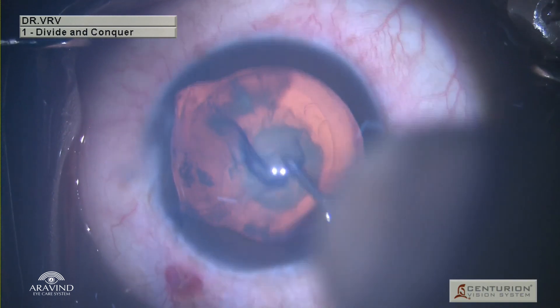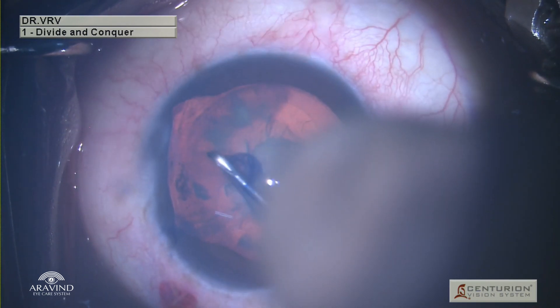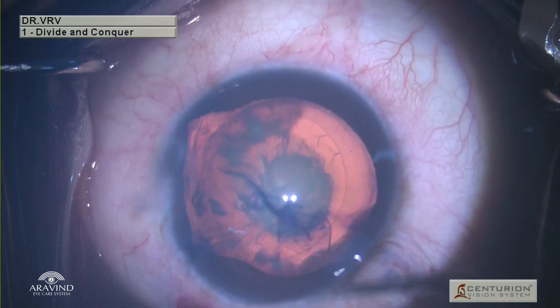When operating on such cases, there is always a tendency for the rhexis to run away at the site of zonular dehiscence. So be careful when you are closer to the zonular dehiscence area.